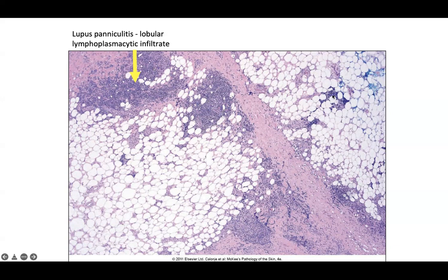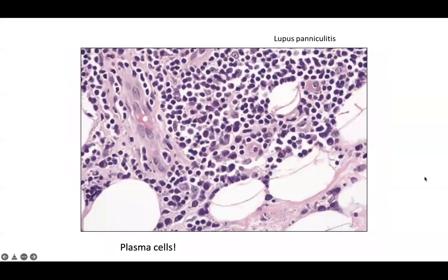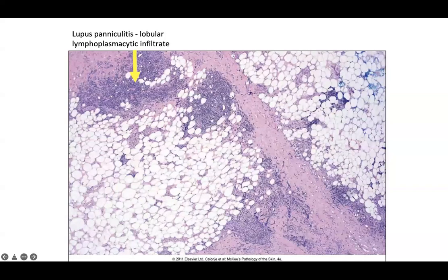On higher power, in between individual adipocytes, you notice lots of plasma cells as well as histiocytes. If you see lots of plasma cells within the infiltrate, consider lupus paniculitis, but you'll want to correlate with the clinical picture as well as low-power lymphoid aggregates within a lobular pattern.